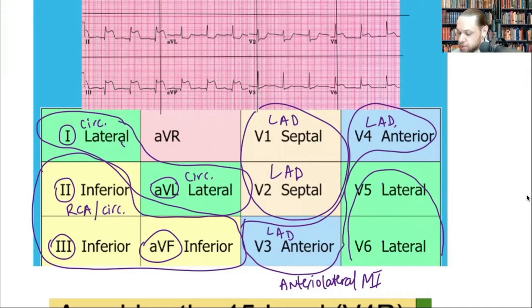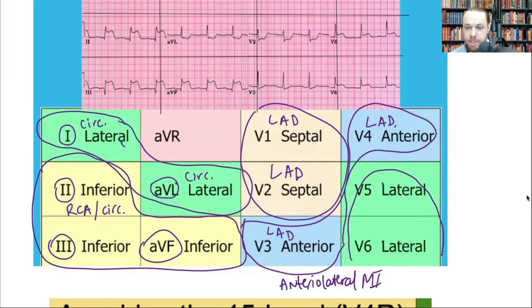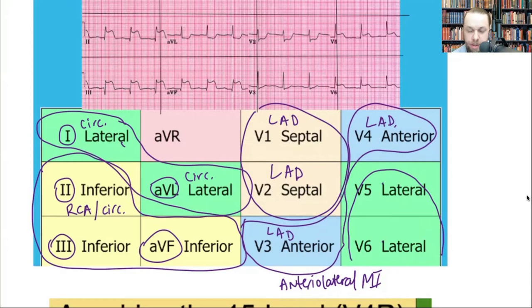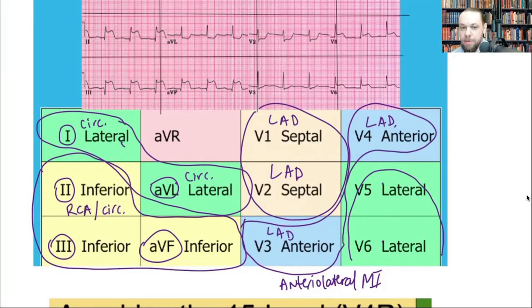For example, leads II, III, and aVF are contiguous because they look at the inferior wall. V1 and V2 are contiguous. But if I see elevations in V4 and also in lead III, those are not contiguous — that could be a different diagnosis or pathology. In pericarditis you can have elevations in multiple leads with different morphology. For our purposes, we're looking for contiguous ST segment changes, and we want to identify which coronary artery is involved.